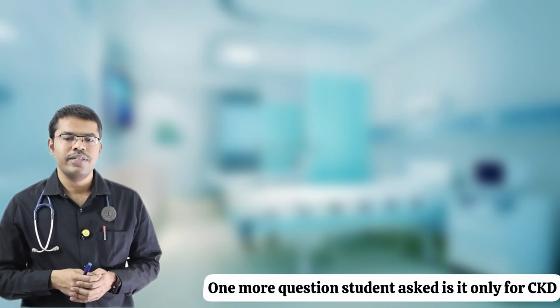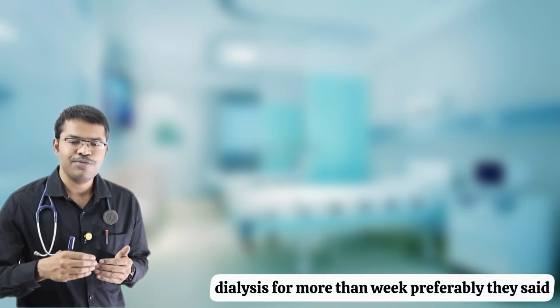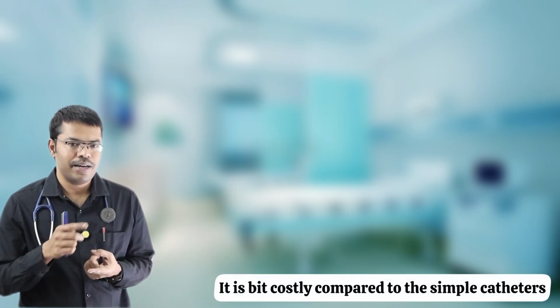One more question students ask: sir, is it only for CKD? As per the guideline, whenever a patient requires dialysis for more than a week, they preferably say to put this Permacath. What is the disadvantage? Cost. It is a bit costly compared to the simple catheters.